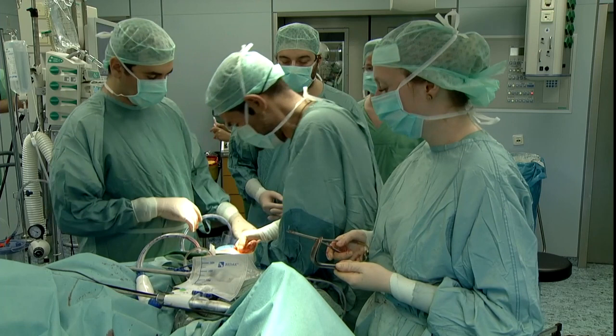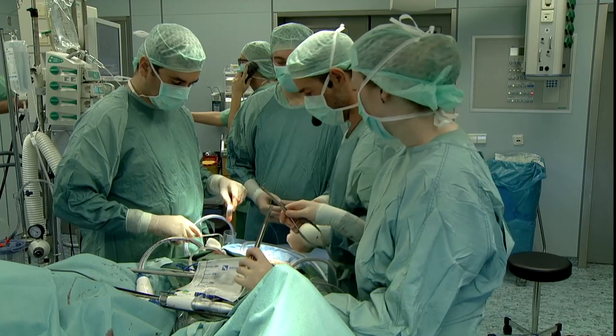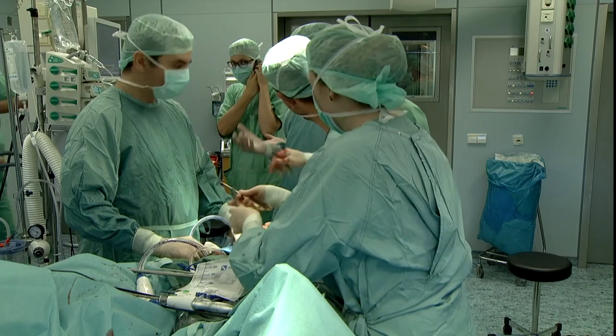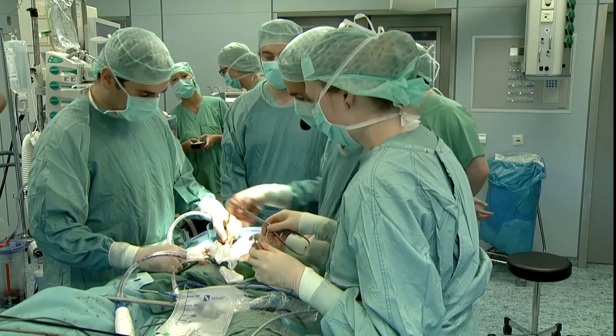He has a hernia on the left side, repaired with a mesh. So give me a Farabeuf and a suture. Good. Can the table come up a bit, please? And straighten the table and come up. Yes, a gauze, please. So we just close our trocars now. We put some tension on the, and this connected on the floor. Good. Let's clean the peritoneum.